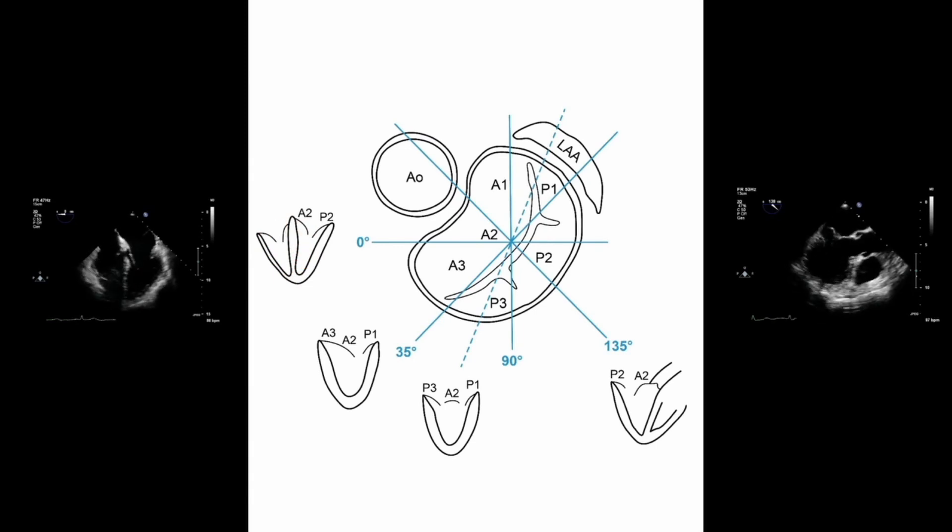The four chamber view is obtained with an imaging plane angle of zero degrees and this cuts through the mitral valve leaflets at the level of the A2 and the P2 segments. So here we have the A2 segment and here we have the P2 segment.